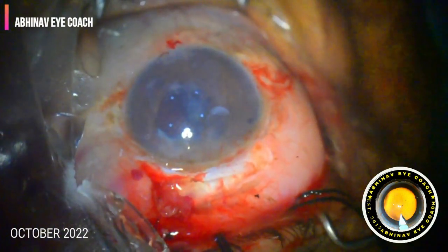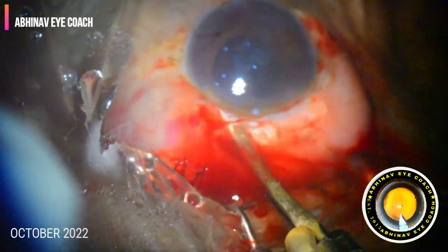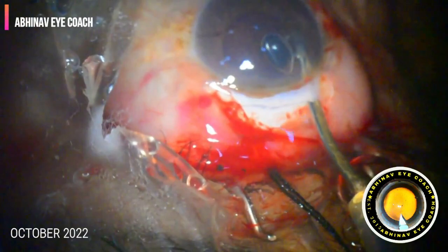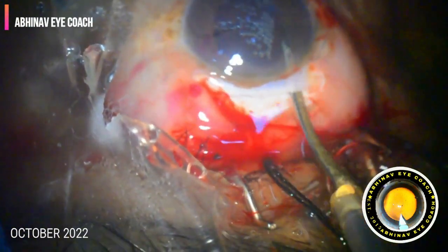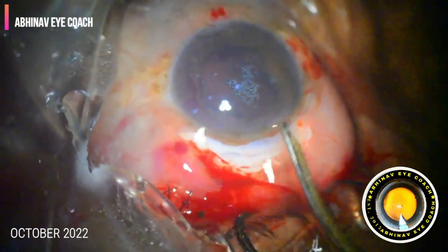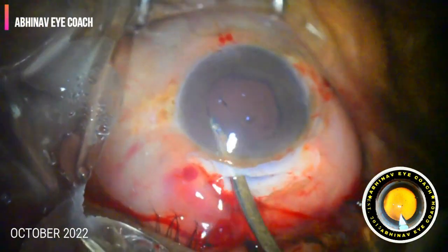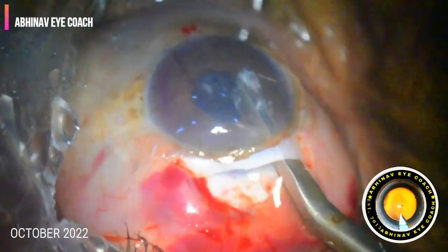The chances of the nucleus falling back into the vitreous cavity were very high, so there was a sigh of relief once the nucleus was out. The remaining cortex was then easily flushed and washed away with the Simcoe cannula. We completely washed the cortex, and here we can clearly see the large posterior capsular defect.